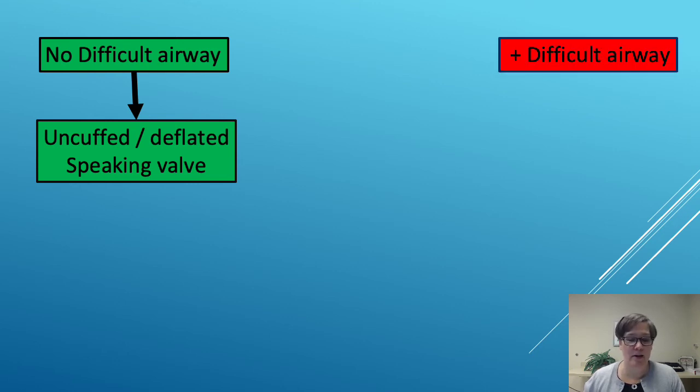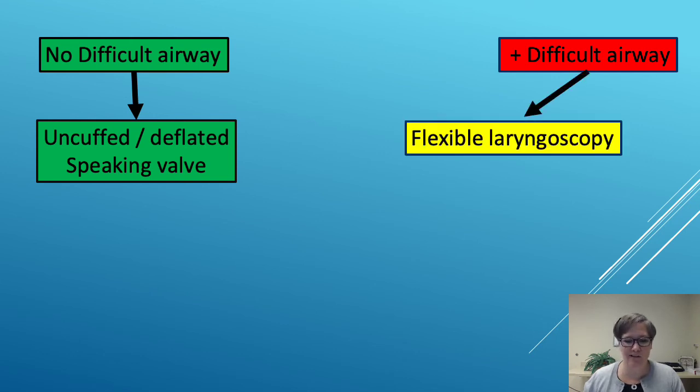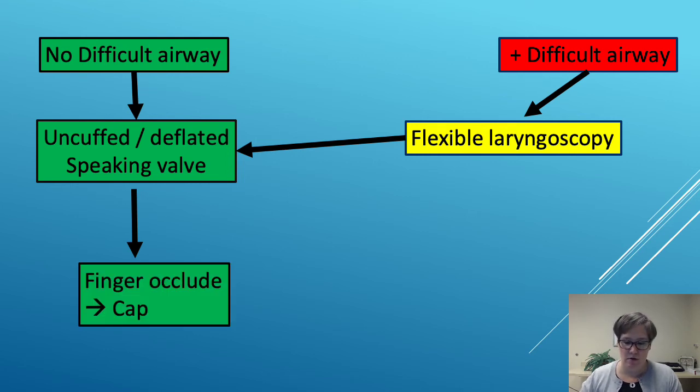However, if the patient has either an altered or possible poor upper airway, I like to look at the larynx before I put on a speaking valve because I want to make sure that that makes sense. All right, so if the speaking valve trial is successful, then I finger occlude the tube. I don't just go straight to cap, I finger occlude. And as I'm obstructing the tube, I hold it there for a little while, you can feel pressure backing up into it. If when I let go, there's not this rush of air that's built up, then I'm feeling a lot more confident about a capping trial.